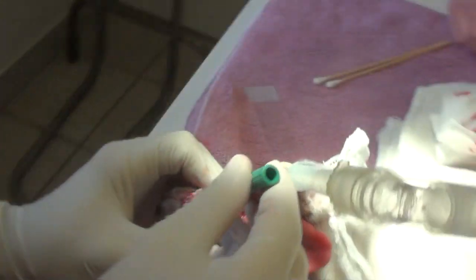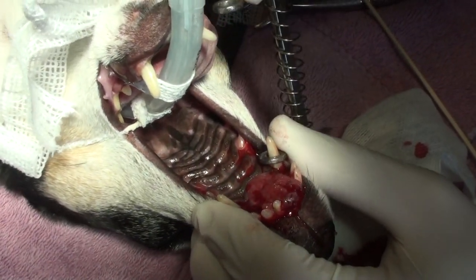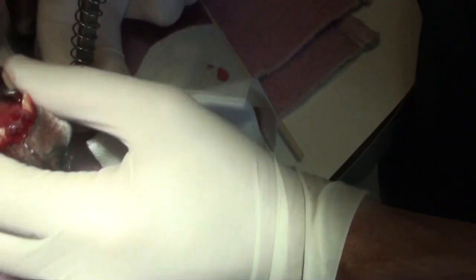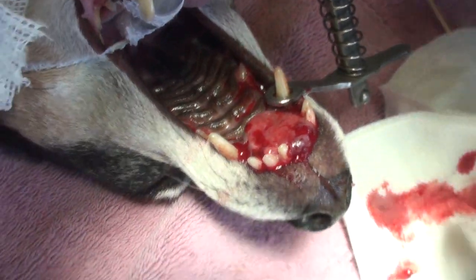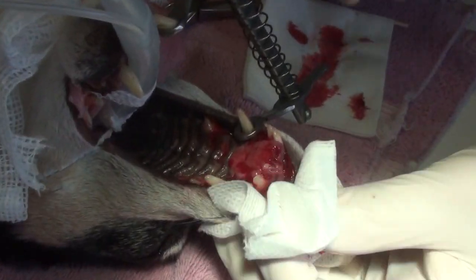I might actually need a little pair of thumb forceps, Rob. And maybe a little needle to get it out of there. And a pair of scissors.